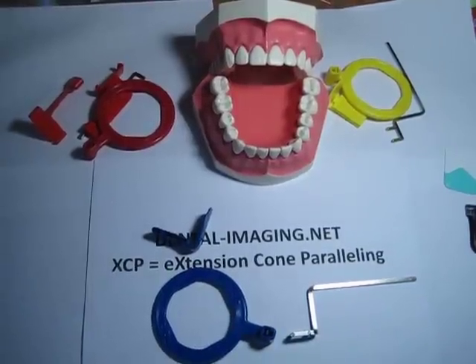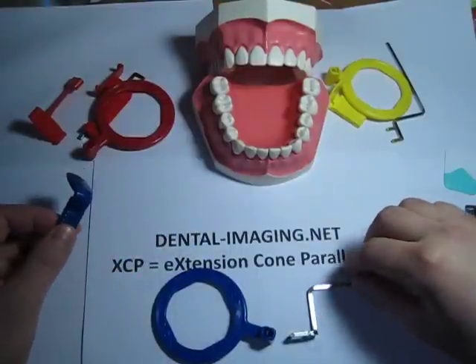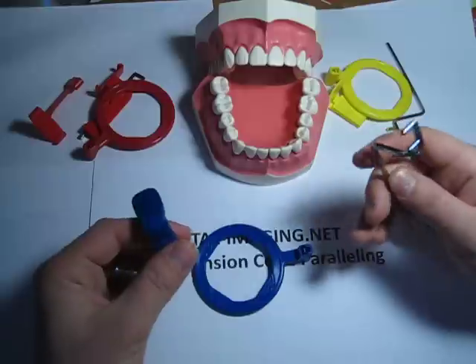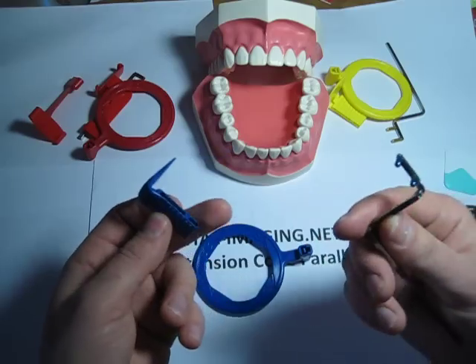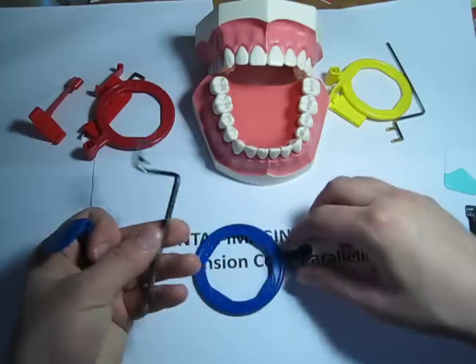Now we'll go over how to use the extension cone paralleling technique. These are XCP holders. The easiest one to assemble is usually the anterior one, which is in blue. You have the bite block here, the metal rod, and the ring.